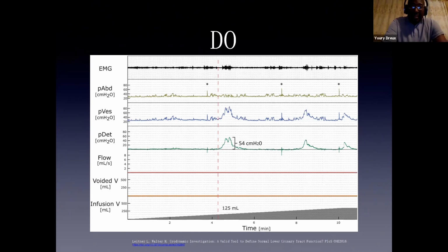I remember one time I was talking to reconstructive guys, and they asked me, how do you do it if you don't have urodynamics? How do you predict if the patient is going to pee, or if he has a bladder failure? And I couldn't answer. I told them we do a lot of counseling, telling the patient that we're going to do the TURP or something like that, but if he cannot urinate after that, he might have this kind of problem.